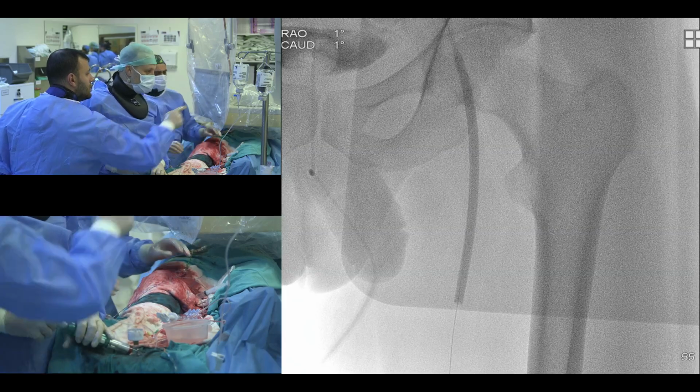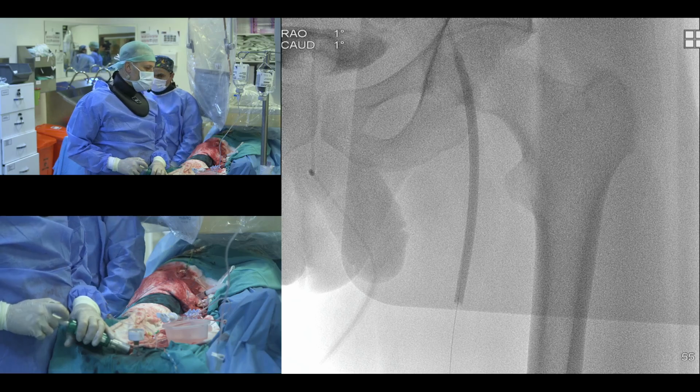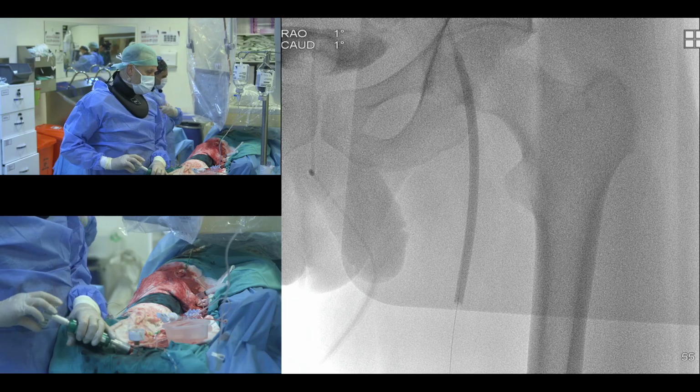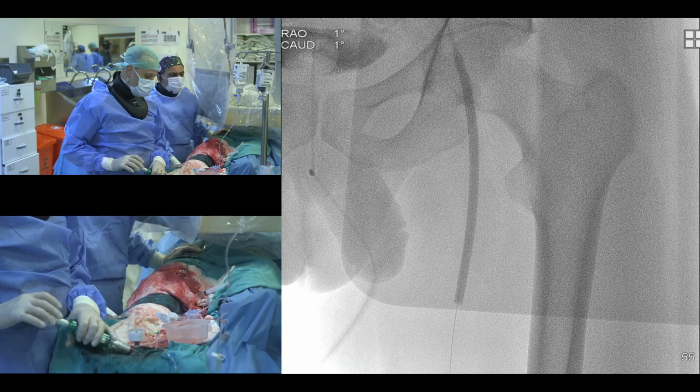What are you guys going to do now? Any suggestions what you would do? Anybody? So I was scratching my head. This is the third time, and I was afraid my teacher in Detroit would think I'm just doing this procedure to make money. I just wanted to get rid of this patient.